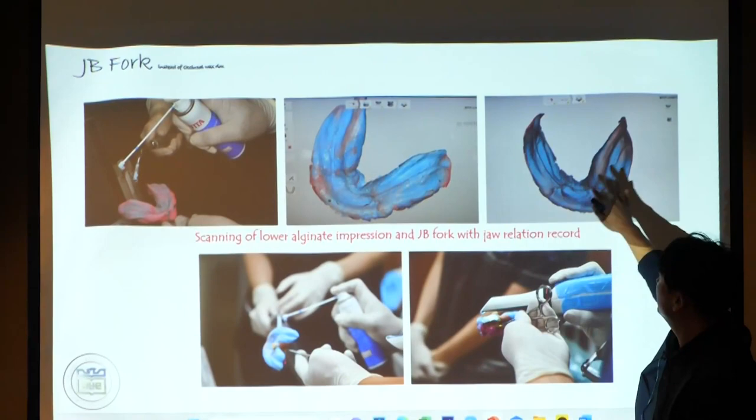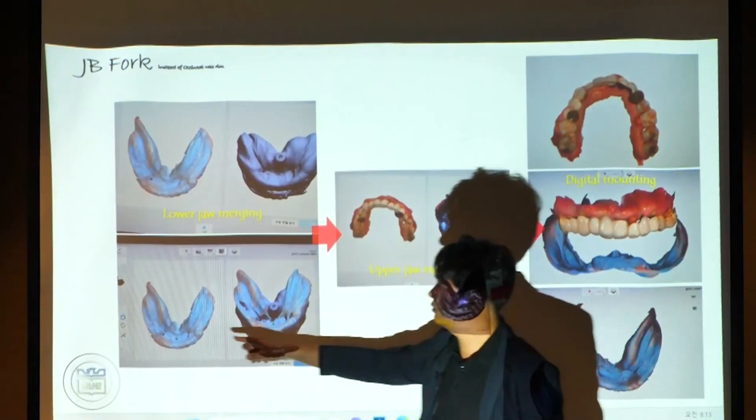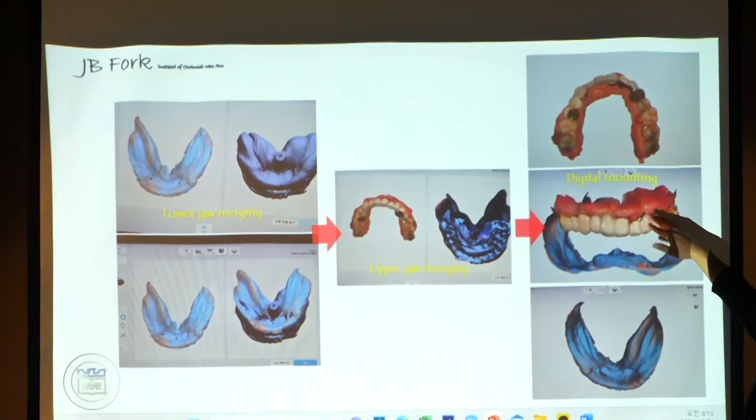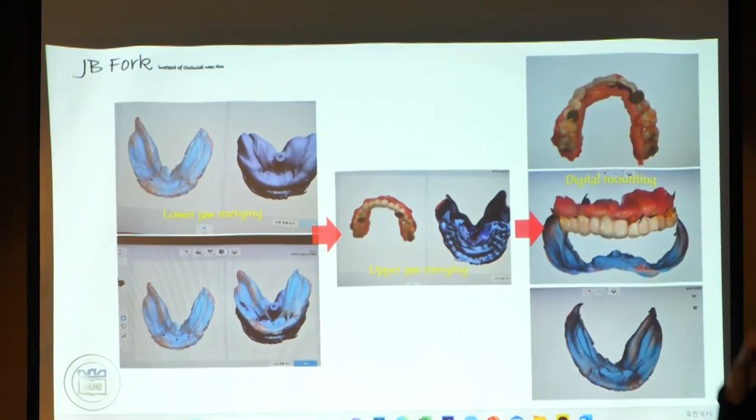This is the lower JB fork scan. Look at this. I click the reference points on the irregularity areas, and then merge them together like this. Then I can get this kind of digital model, with the upper teeth and the lower edentulous mounted scan data. After sending this data to the dental technician, it is very easy to design.